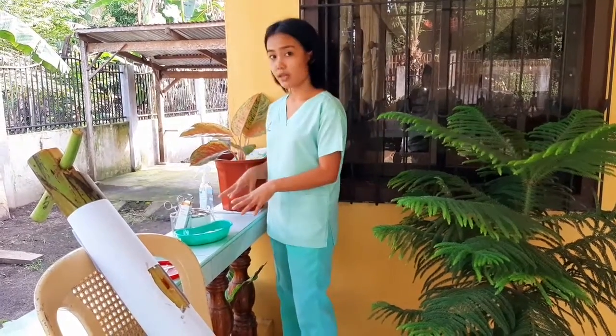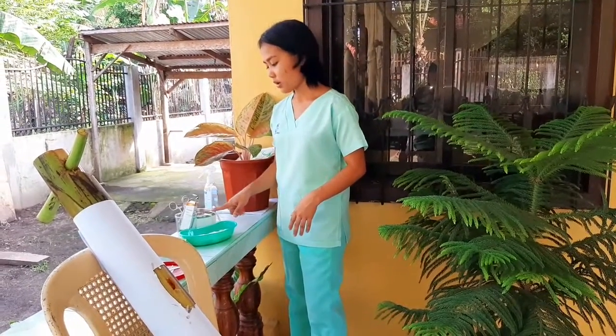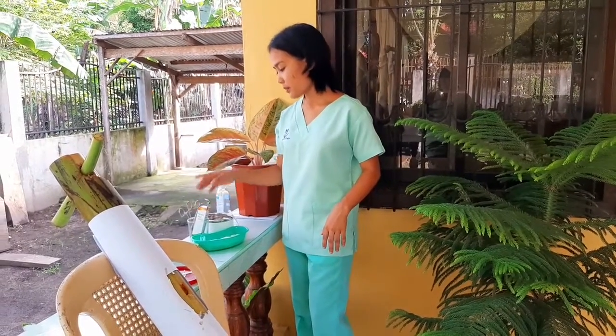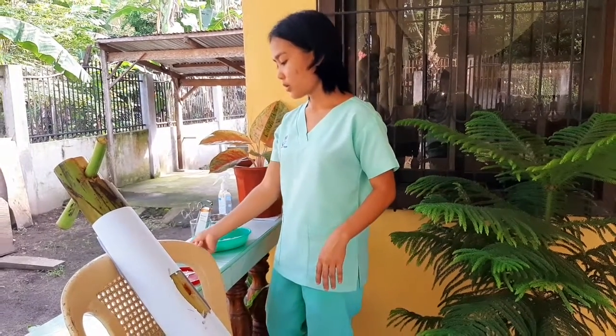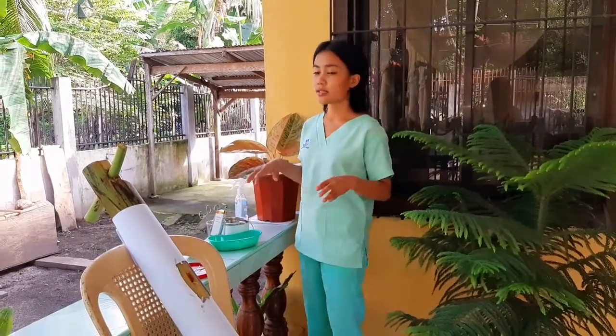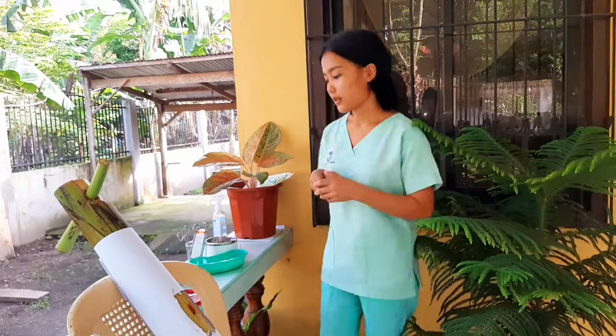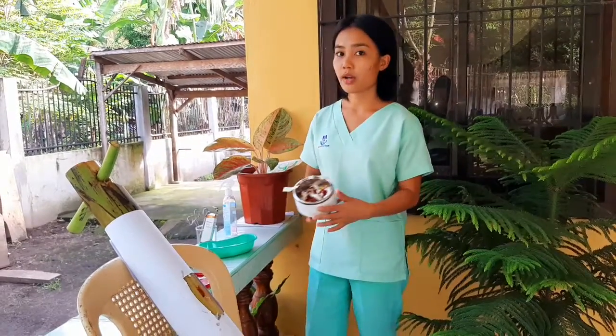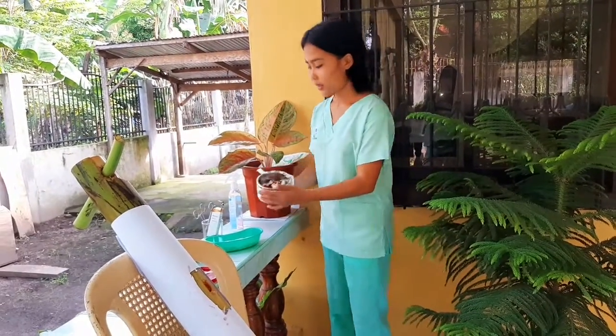I already prepared here the gauze, the wet cotton balls with betadine, my forceps, alcohol, and dry cotton balls. Make sure that all the sterile supplies are placed on the side table near your patient, and then you can apply the dressing. Then we pour betadine onto the wet cotton balls. I already have the supplies here.